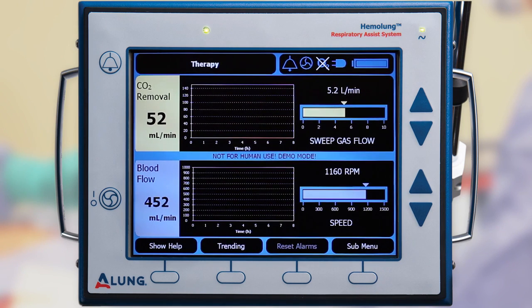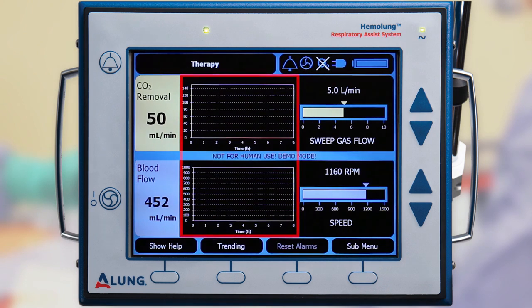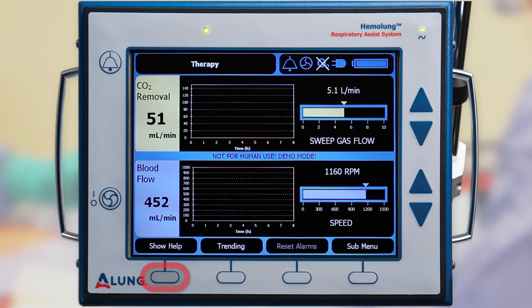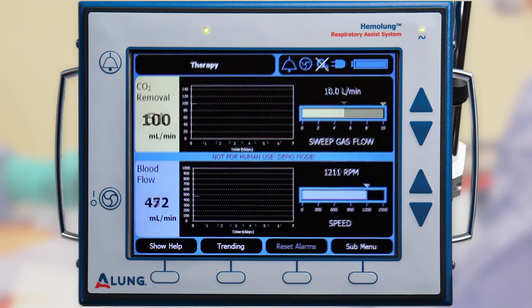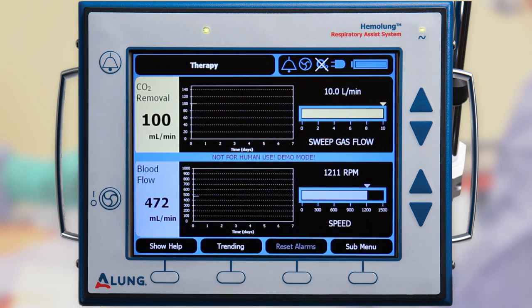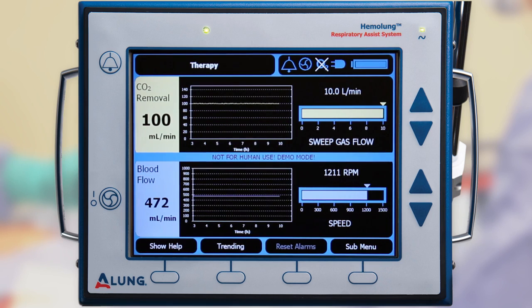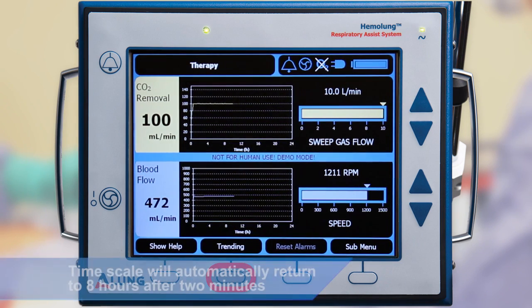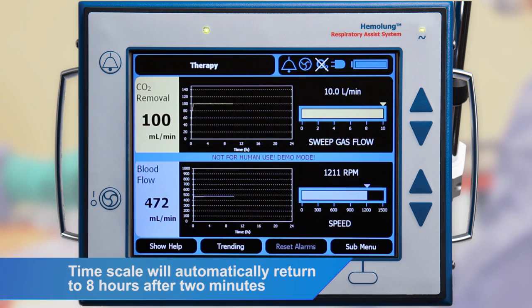The main therapy screen is the primary screen used while the Hemolung RAS is providing therapy. This screen allows you to view CO2 removal rate and blood flow rate, evaluate trending therapy data, and obtain help on system operation and alarms. To change the historical CO2 removal graphic, press the trending button to cycle between 8 hours, 24 hours, and 7 days.